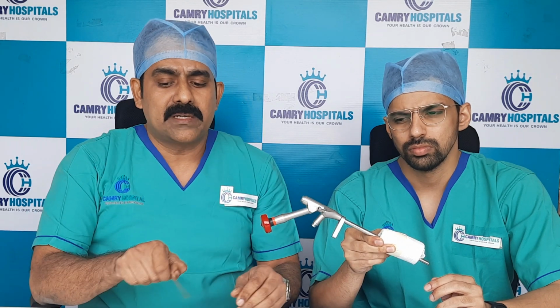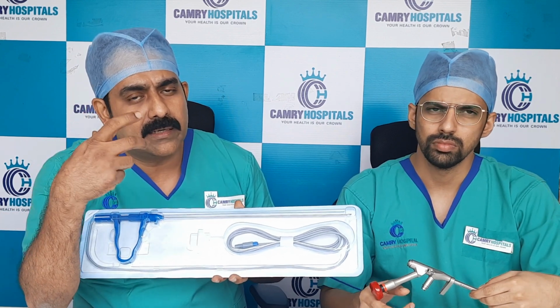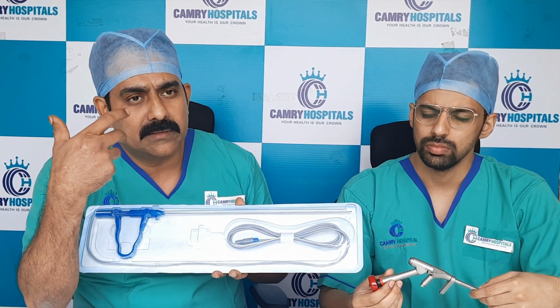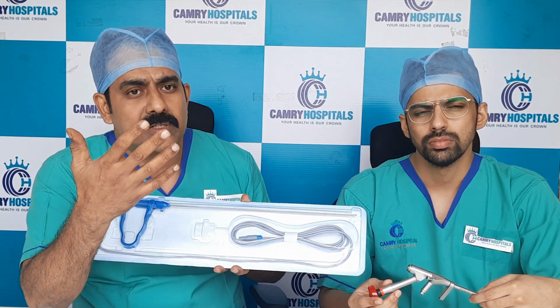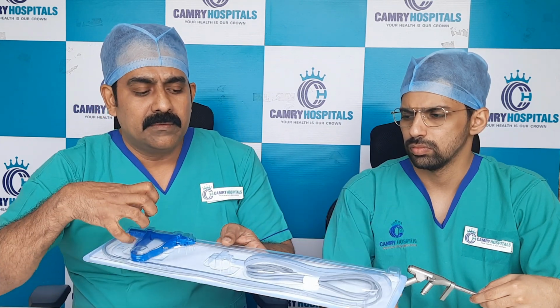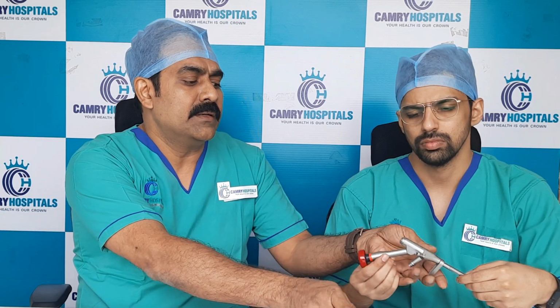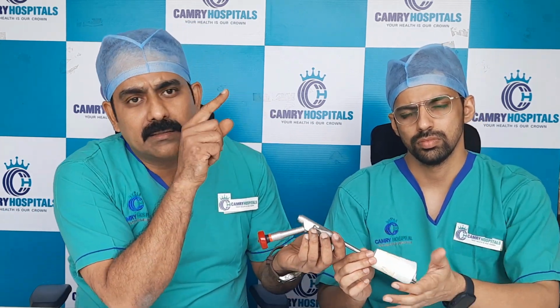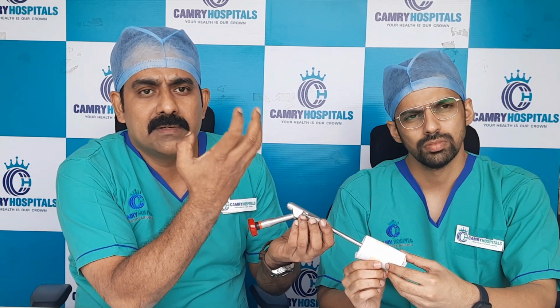And we use special RF, it's called radio frequency probes, which generate just radio frequency, not an electric current. The radio frequency does not generate much heat; the tissues don't heat up. It's a sterile instrument, so we're not opening it. We connect it to an RF generator, then this can also go into the scope and we can cauterize the tissues, we can shrink the tissues, so the nerve is absolutely free.